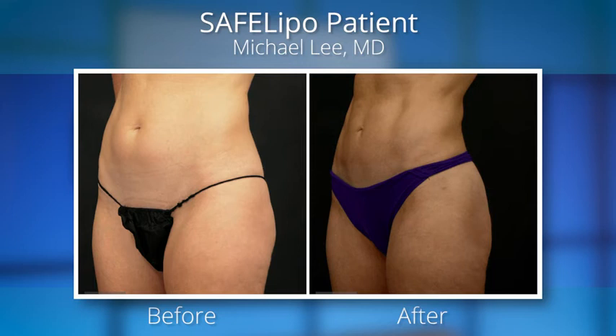With the new instrumentation, we can address a broader range of patients. We're not confined to that traditional idea of who is a good patient for liposuction — we can treat more people.